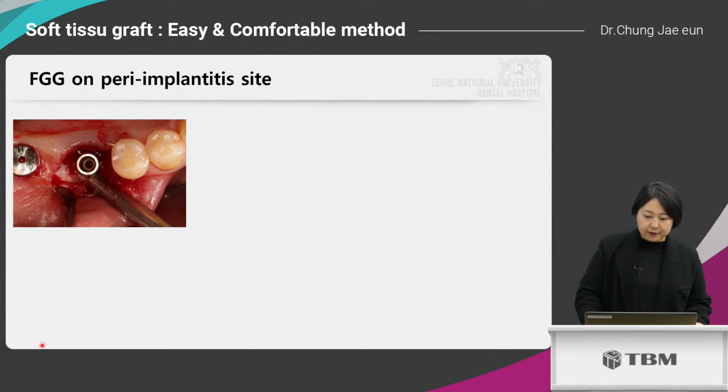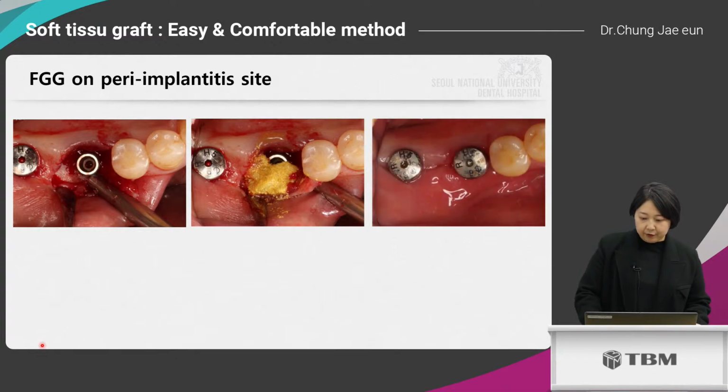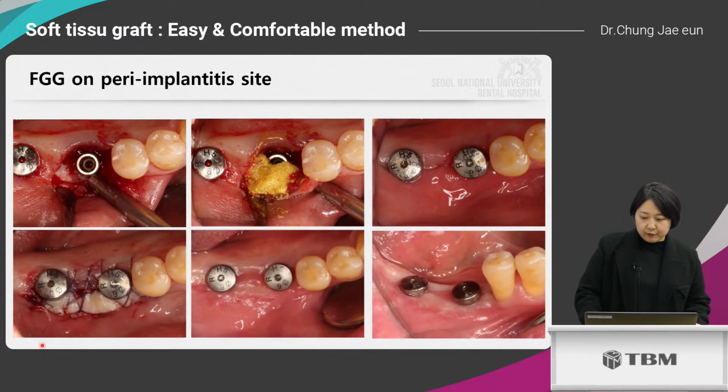Peri-implantitis is treated first. Flap was elevated, and local factors like calculus, plaque, and cement remnants were cleaned with an ultrasonic scaler or any other rotary instrument. Tetracycline-soaked cotton pellets were placed at the exposed implant surface for about 2 minutes, and bone graft with collagen membrane was used for regeneration. After healing, free gingiva graft was also done due to the lack of keratinized gingiva. The graft was a little bit small at the distal side, so it was a bit short of the second molar.